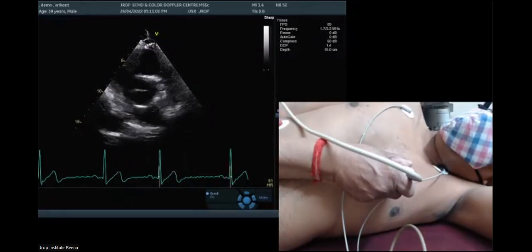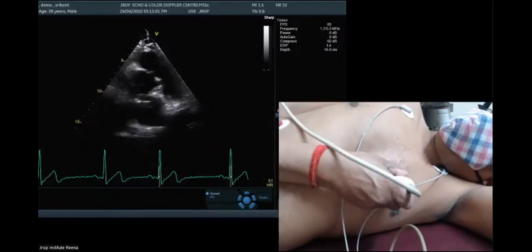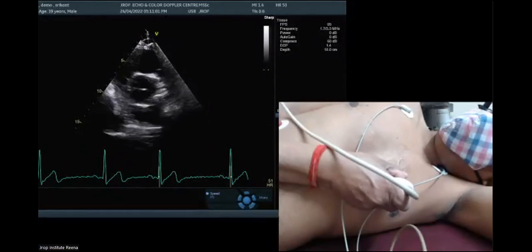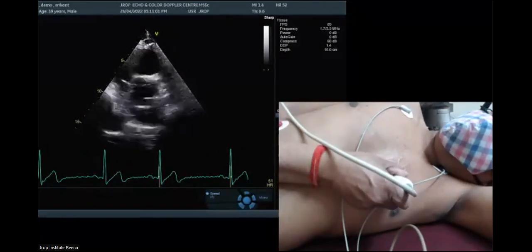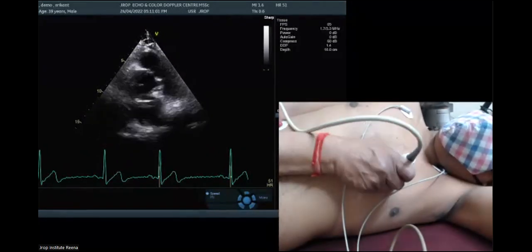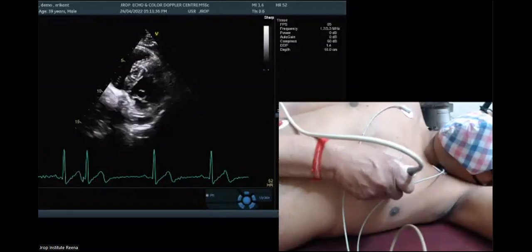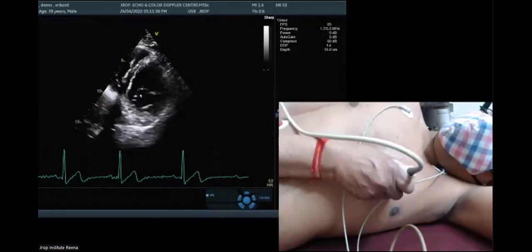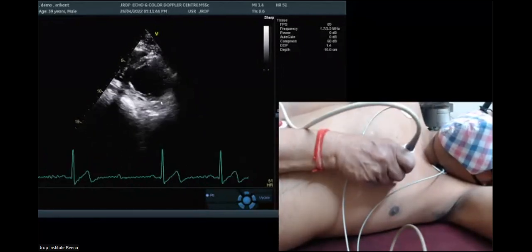And for everybody who has attended the program before and those who have not, here is the aorta in the center. Here is the tricuspid valve. Here is RV. RVOT is the pulmonic valve. And you realize them much better when you are looking at this in motion, not in a static position. So now the footprint is looking towards the aorta. Then we go back and gradually the footprint is at the second or third intercostal space. This is my mitral valve, so I can do a planimetry in this mitral valve. Now this is my papillary muscles level. And finally the apex level.